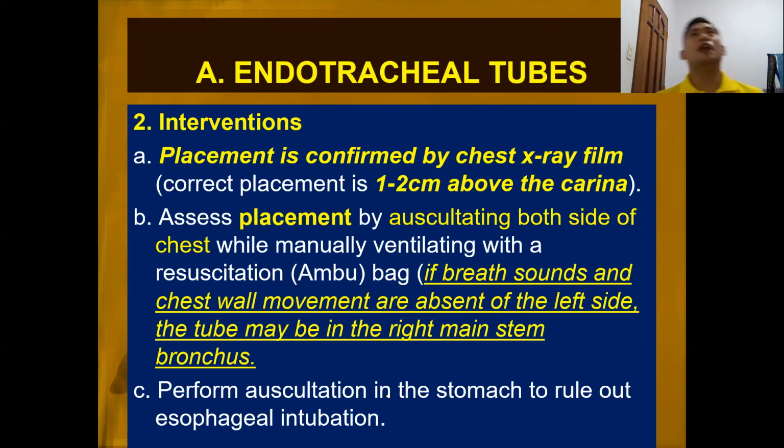But in our setting, especially in government hospitals or even in hospitals here in our locality, ang gagawin na lang to check the patency or the correct placement of the tube is to auscultate the lung fields as well as the stomach. Okay, kasi we attach it to our ambu bag or the resuscitator, and pag pump dapat equal, may lung sound dito, and then pag pump again may lung sound dito.